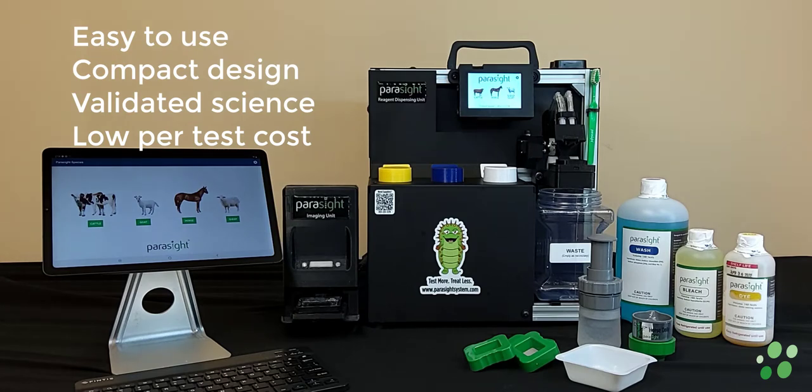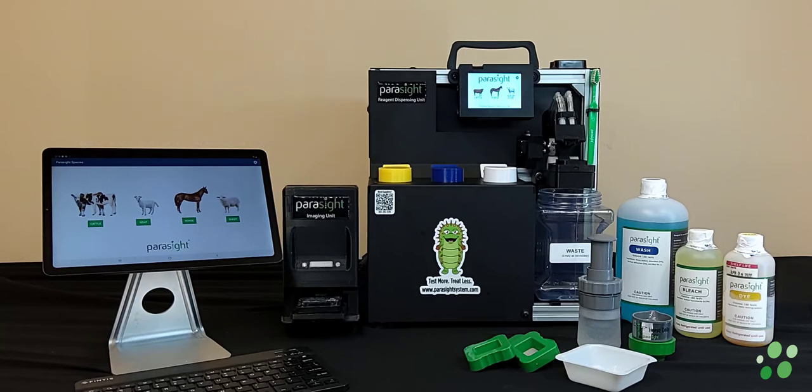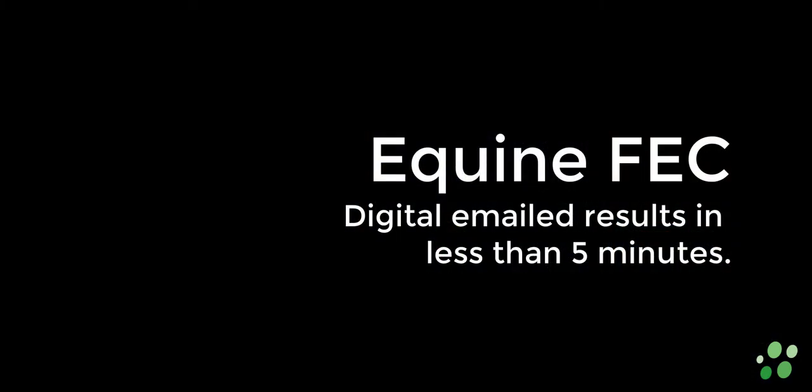Let's take a closer look at how this technology improves the way you provide animal health care with the push of a button. Here you see the complete setup needed to perform an equine fecal count in less than 5 minutes.